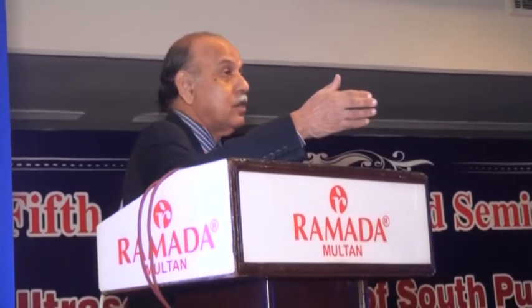Is there any clinical importance of increased placental thickness? I just mentioned that if you have a thick placenta, you are dealing with diabetes, Rh incompatibility, or maybe an underlying chromosomal abnormality. There are certain drugs like indomethacin, which have an adverse effect on the placenta, and a thick placenta may be an underlying cause for even chromosomal abnormality. So for a thick placenta, if you have excluded segmental contraction, then you have to take it seriously.